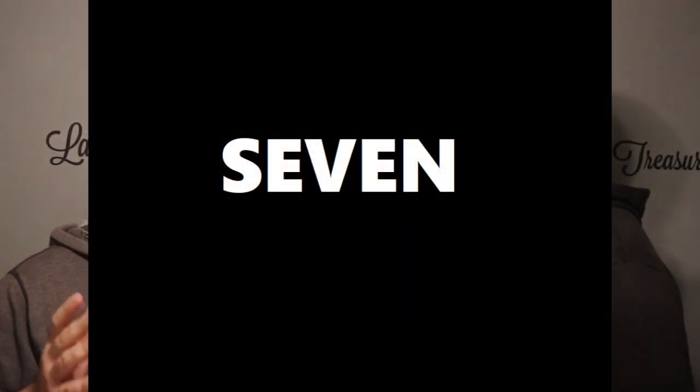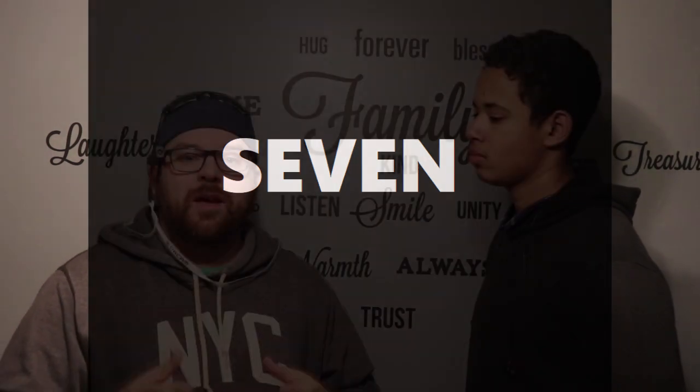All right, everybody. And lastly, we got face recognition. And the ORCAM does a really great job with that. So I'm going to demonstrate how to do that right now. So what you're going to do is face the person you want. They're going to be about 2.5 feet away or 3 feet. And you are going to just take your index finger and place it on the center of the ORCAM device on the tactile line. So try to get the middle, and it will all take care of itself because the ORCAM will tell you exactly what it needs to do for the process to be finished. So I'm going to demonstrate this now.